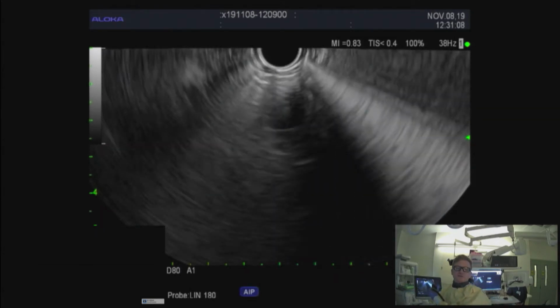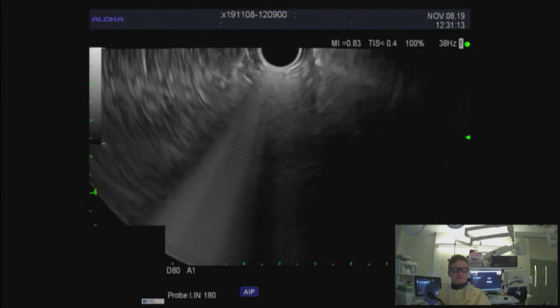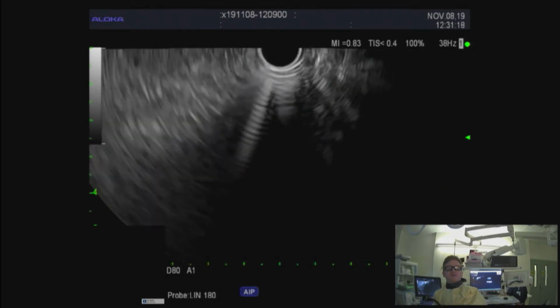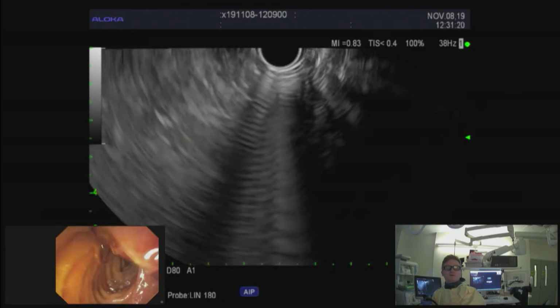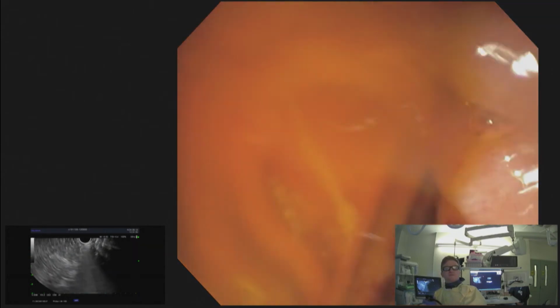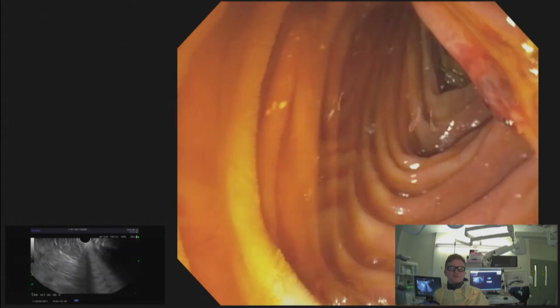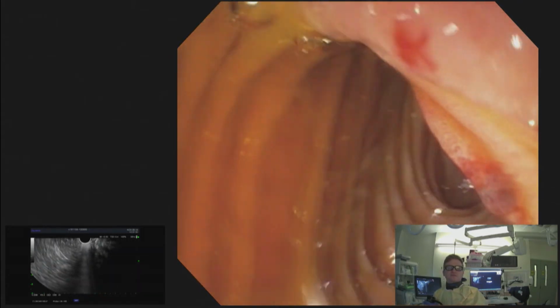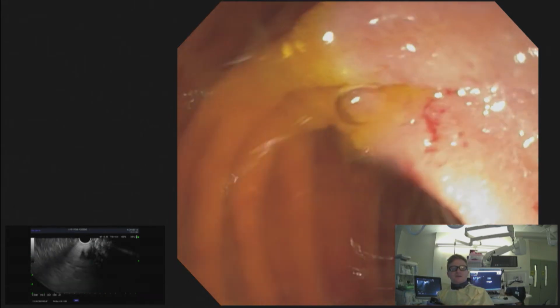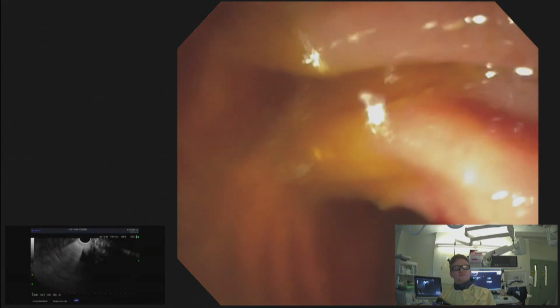I think it doesn't look distinct like a mass. Here, I can show, can we switch to the endoscopic view? So we'll also show an endoscopic view to further exclude concern for mass. Which also looks extraductal, so I can see tapering, and then it's the soft tissue around the ampulla where we're seeing a hypoechogenicity, consistent with inflammation probably from stone passage.